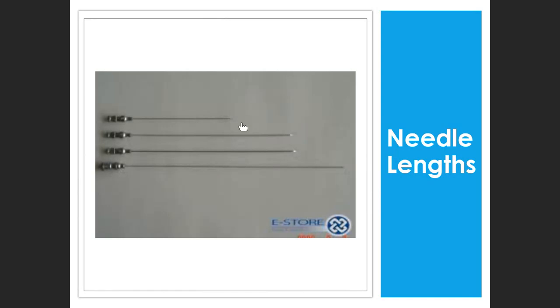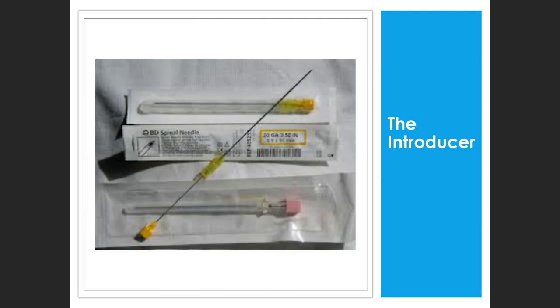Needle lengths vary depending on the patient we're doing. A child is going to need a shorter needle. A plump person with a lot of subcutaneous coverage on the back is going to need a longer needle, of course. That follows. Right? Can you see? Yes, that's a 20, so the yellow is a 20 gauge. Can you see that?